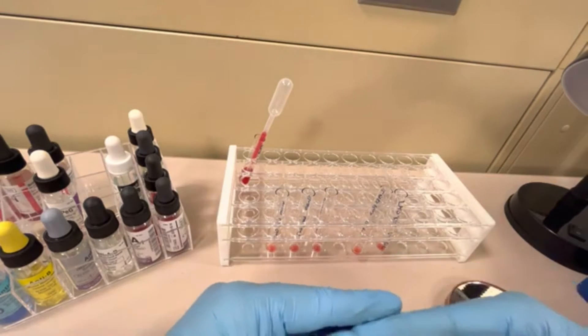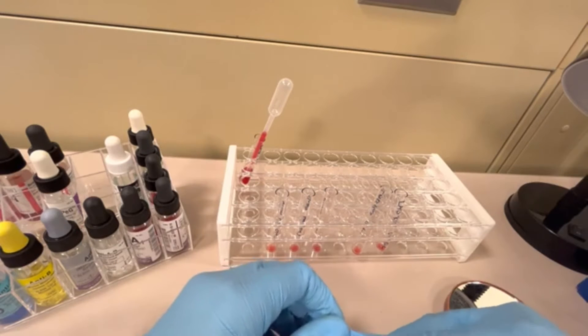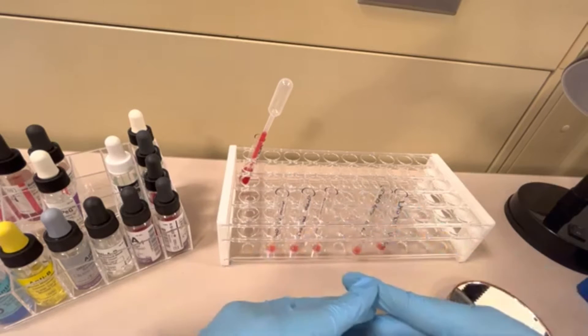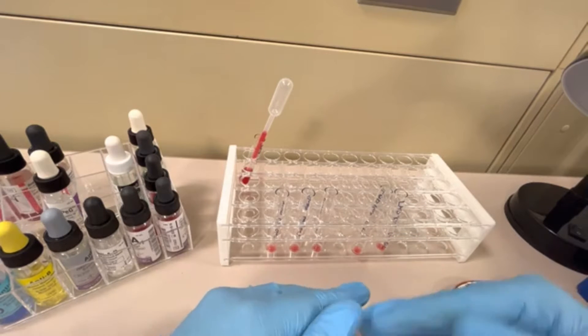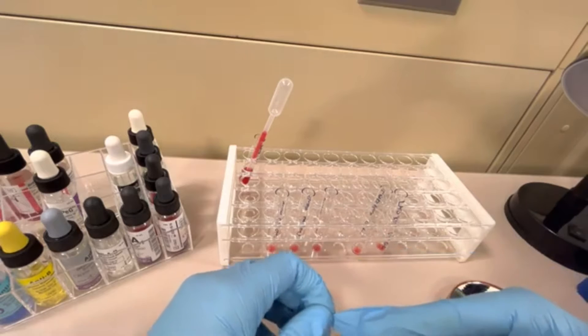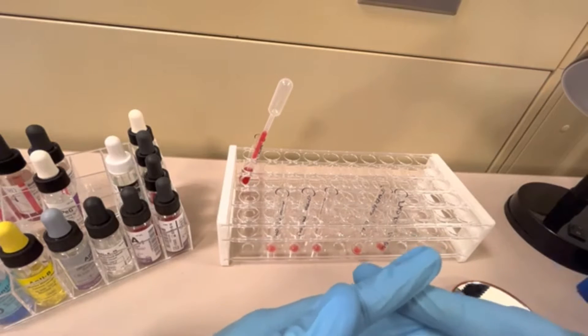You can use an automated cell washer. These are instruments that you put the tubes in and tell it how many times you want to wash it, and it just automatically does it. Or you can do it manually.